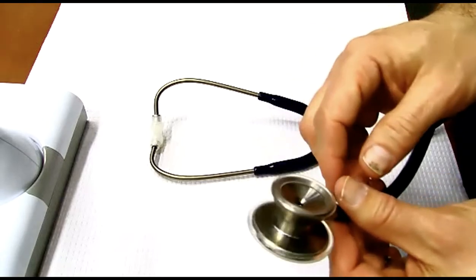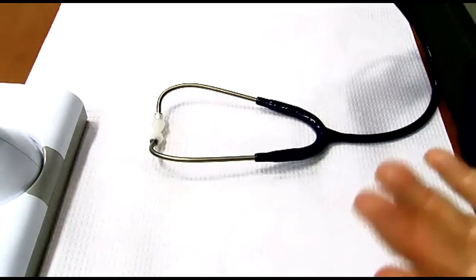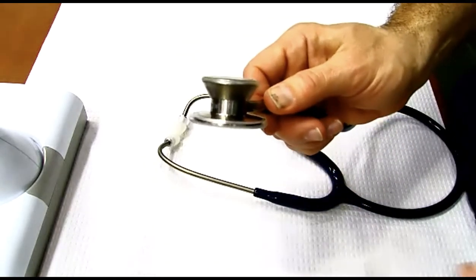So there are a lot of people that say, I can definitely hear it better with the bell. So let me ask you, on the test, you can use either side. How will you know which one is better for you? You've got to try it.